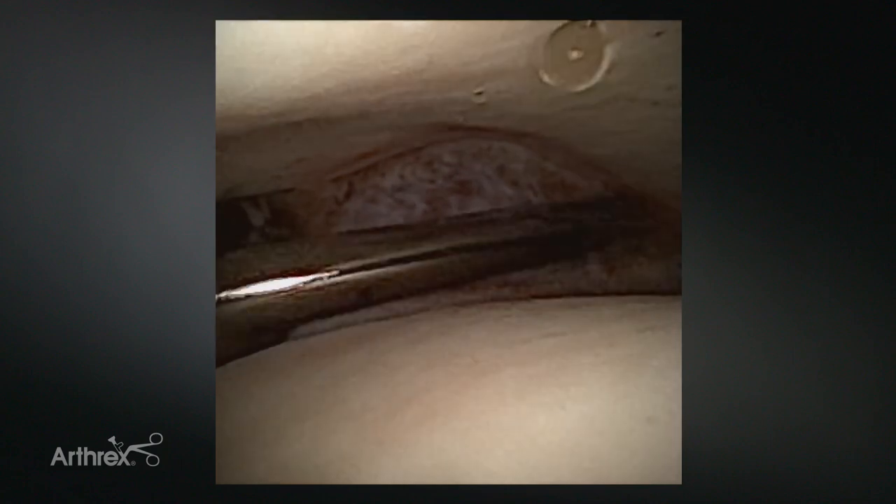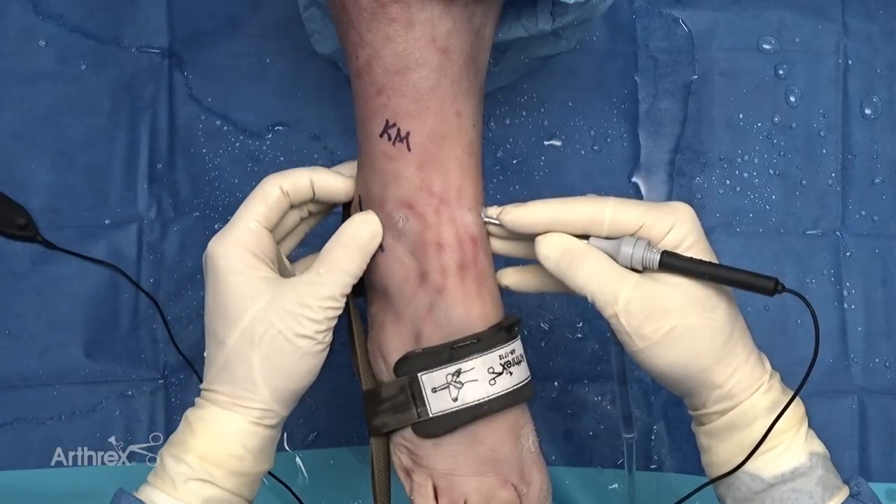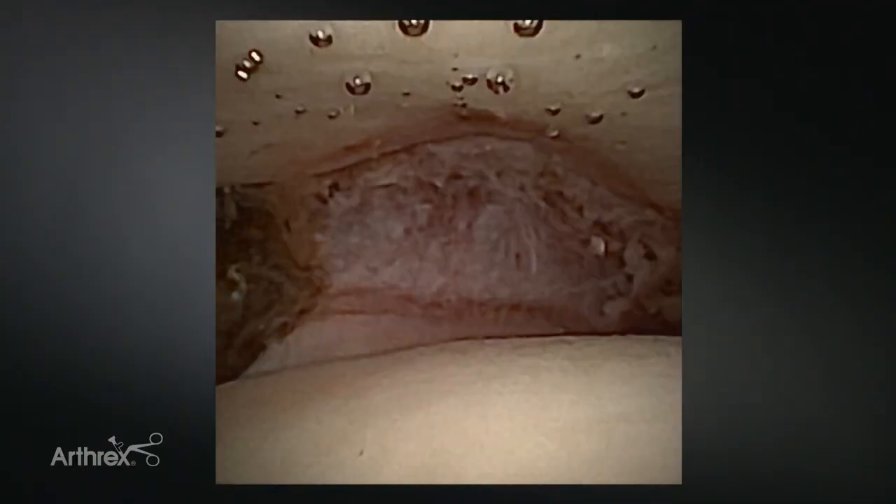The shaver does a nice job of taking tissue down, and by moving it, I'm not getting into my articular cartilage, which really improves visualization nicely. If I want to check my syndesmosis, I can do a fibular translation test — stick a diagnostic probe in there and see if there's any instability. With direct visualization, it really ensures I'm making the proper diagnosis moving forward.